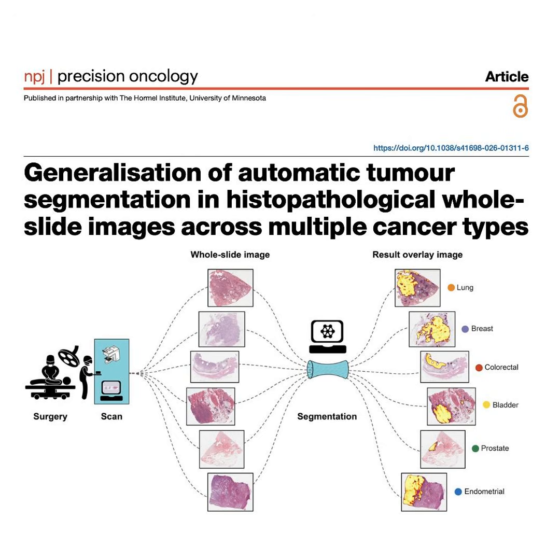You can. And the researchers proved you can do exactly that. If you simply lower those post-processing thresholds, the AI suddenly finds the bladder cancer and the accuracy jumps all the way up to an 89% DSC. Okay, but what's the catch? It is a delicate, dangerous balancing act. If you make the AI hypersensitive just to catch every faint whisper of cancer in a fragmented biopsy, you risk creating false positives everywhere else in the perfectly healthy tissue.